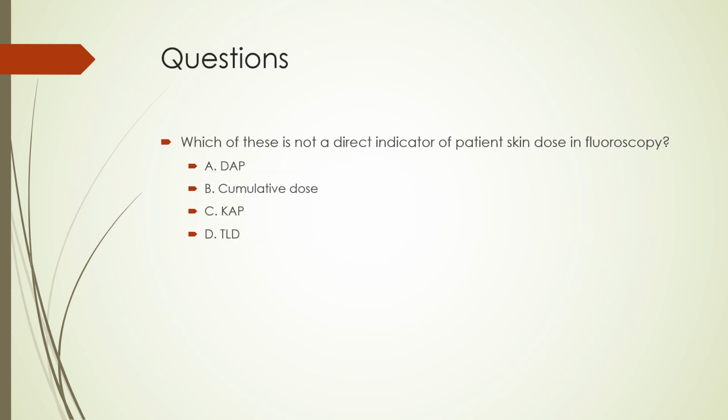Let's finish up with a few questions. First question: which of these is not a direct indicator of patient skin dose in fluoroscopy? Your choices are A. DAP, B. Cumulative dose, C. KAP, D. TLD. The correct choice is D.